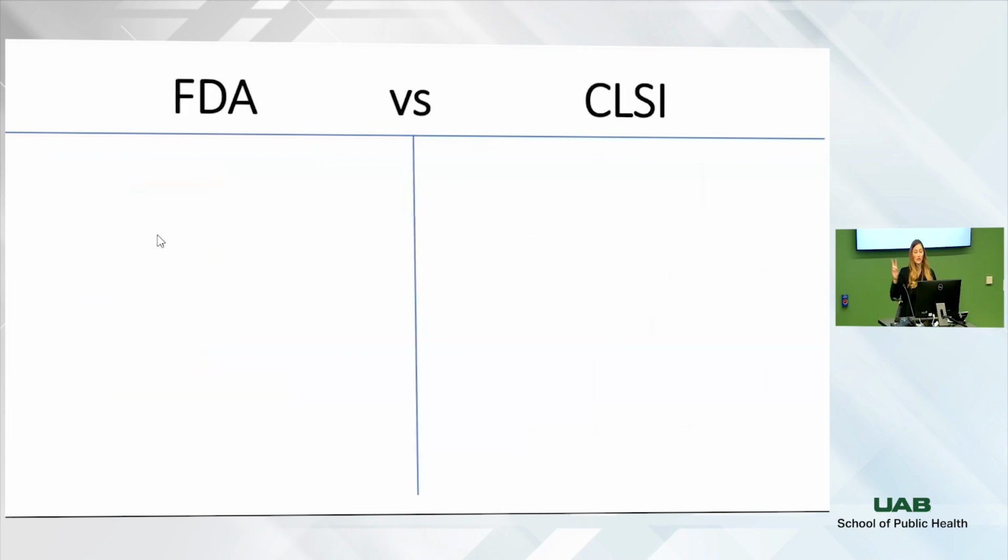All right, so there's two different regulatory agencies that kind of oversee development of these breakpoints, changes in these breakpoints, and how this data goes from the lab setting to the clinical setting and is used and understood in patient context. So FDA, everyone knows what the FDA is, right? Would hope so. And then we have another organization called the Clinical Laboratory Standards Institute, or CLSI.